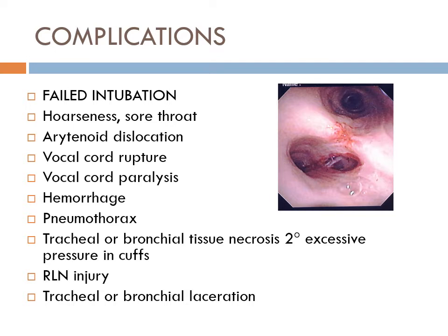So where is this laceration or this bronchial tear? Yeah, it's just left to the carina. What kind of tube do you think the people put in? Left side. Yeah, it's probably a left double lumen tube.